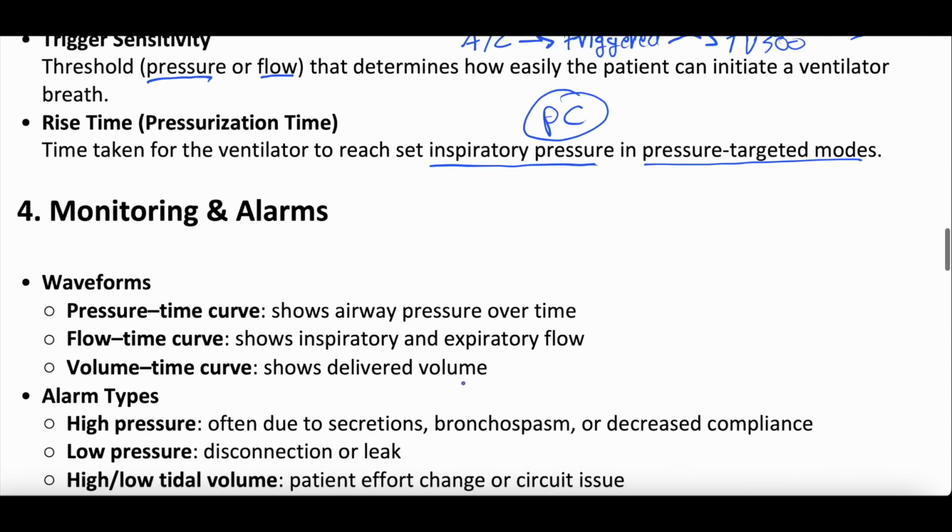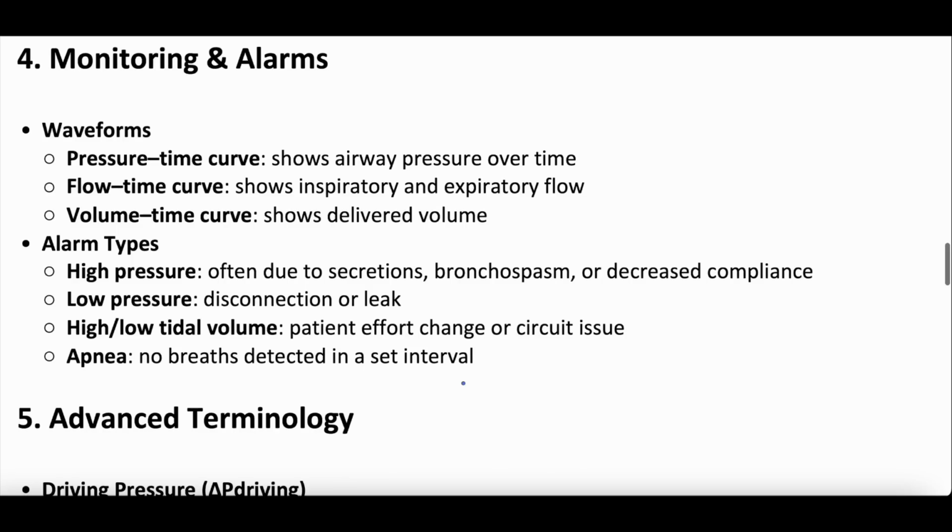All right. Monitoring and alarms. We're going to fly through this because waveforms, there's 3 waveforms we talk about. We have episodes on all 3 of these waveforms. The one that's usually kind of on the top is the pressure versus time. The one in the middle is usually flow versus time, and the one on the bottom is volume versus time.